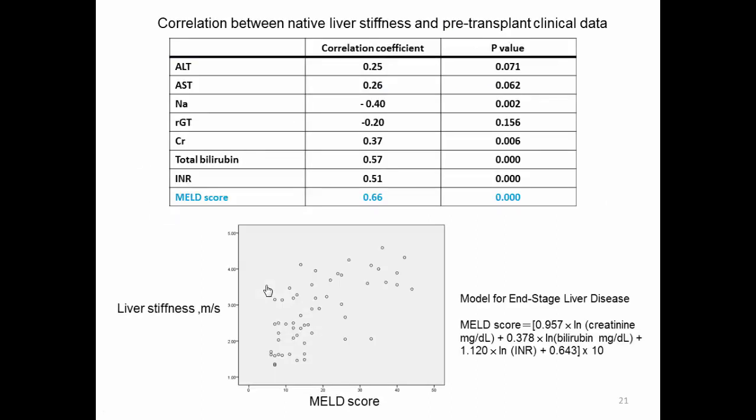And we have been using liver elastography for evaluation of the patient before transplant. We found that there is a significant correlation of the liver stiffness and the MELD score, which is a scoring system that assesses the severity of the chronic liver disease.